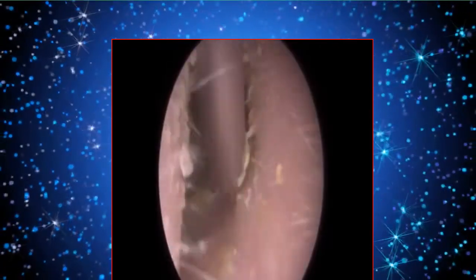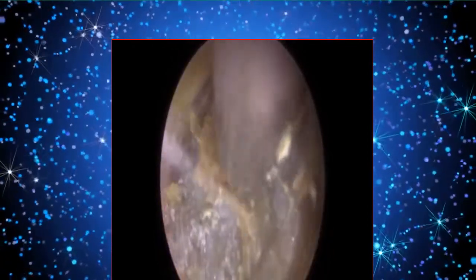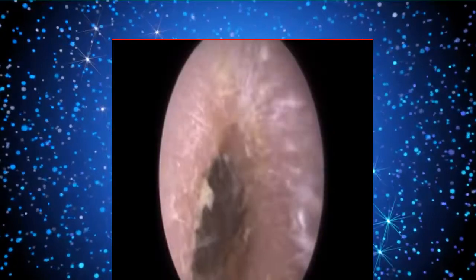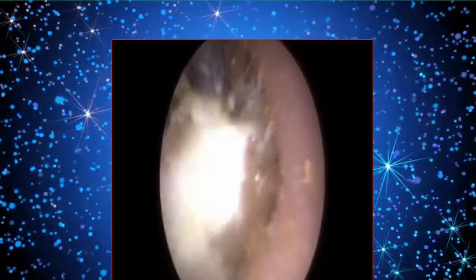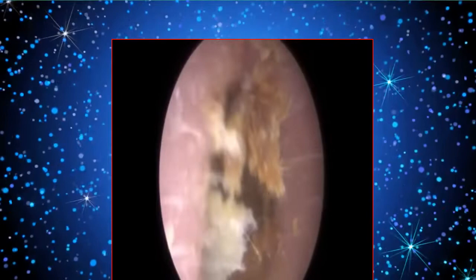There they are — there's so much in there, still quite a lot more. You may have noticed there's a bit of fogging. Fogging of the lens is quite common when someone's got otitis externa, because there's a bit of an outer ear infection, and that increases the temperature. Because the tip of the endoscope is at a cooler temperature than the core temperature of the ear, you get condensation on the tip of the endoscope — the lens — just very momentarily. Then that condensation does go, because the optical fibers that run through the endoscope dissipate the heat, so it does heat up the tip of the endoscope very quickly indeed.